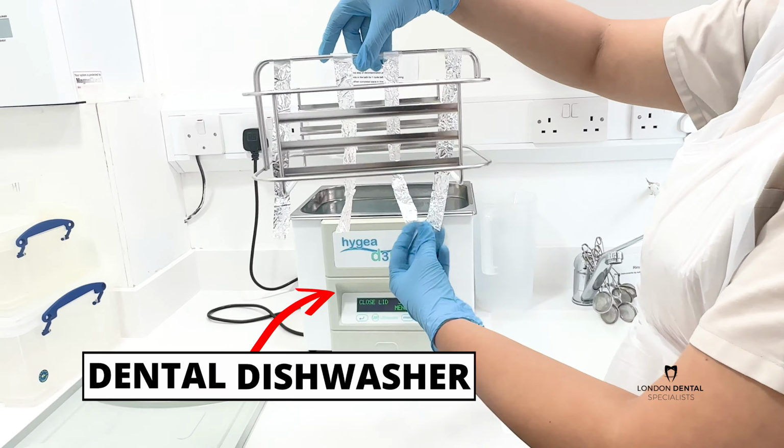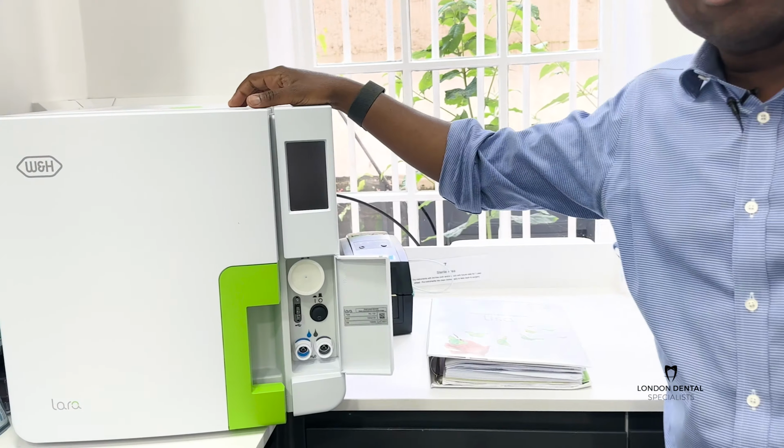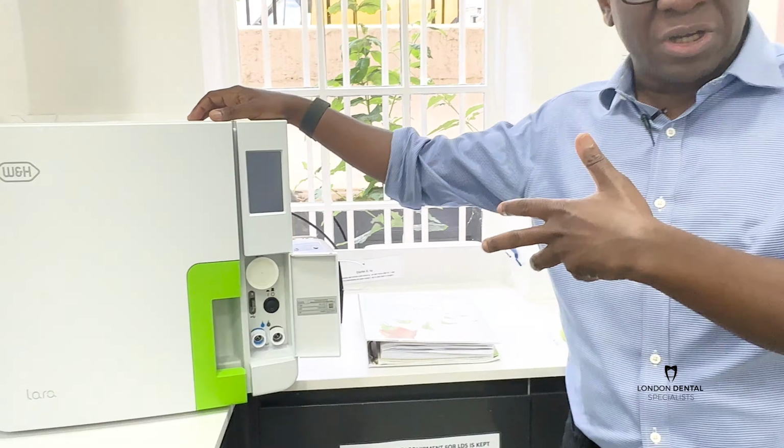The main piece of equipment that we use to ensure that our instruments are sterile before we use them is our autoclave. And one of the things I want to show you is how we not only use the autoclave on a daily basis to ensure that the instruments are sterile, but we also validate that the autoclave is working according to manufacturer's specs by doing 2 tests specified legally. Those are the standards in the UK for keeping instruments clean.